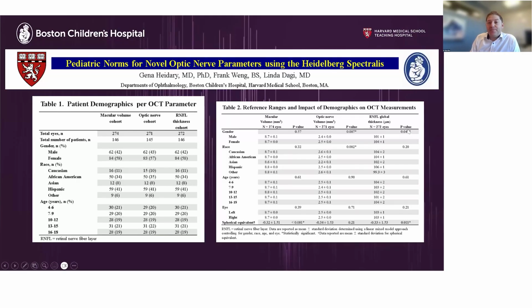global RNFL thickness. If you look at the new prospective pseudotumor trial in children that's starting, the PPTS led by CHOP, their criteria for inclusion actually requires RNFLs to be over 130. So I use 100 to 120 as my usually pretty good zone, and 120 to 130 as my gray zone, and then 130 plus is not always a swollen nerve, but it does make me a little bit more concerned. So it's just ways that I kind of can help.